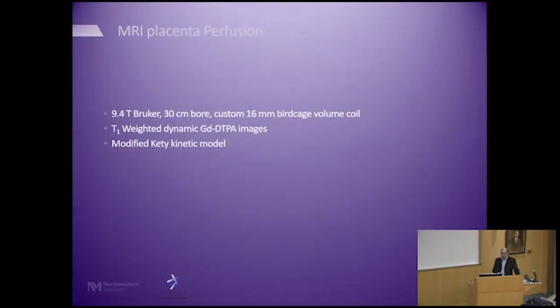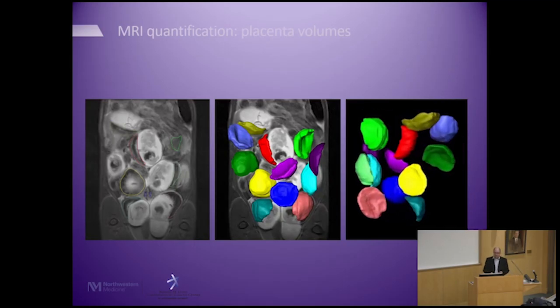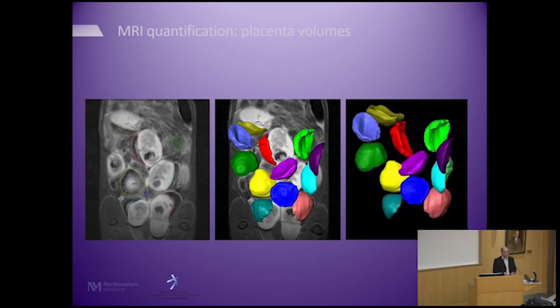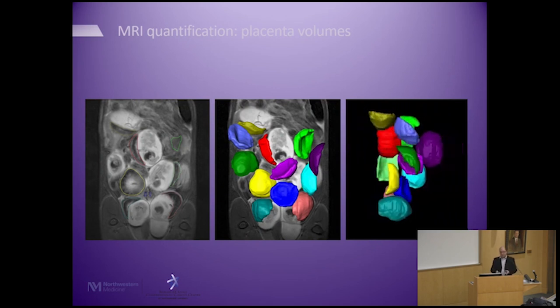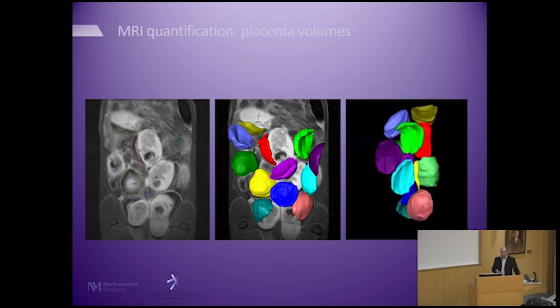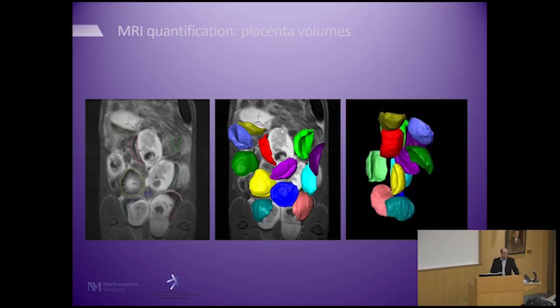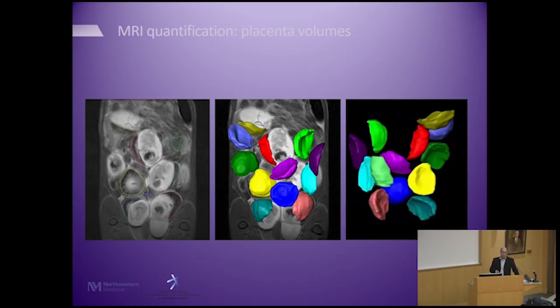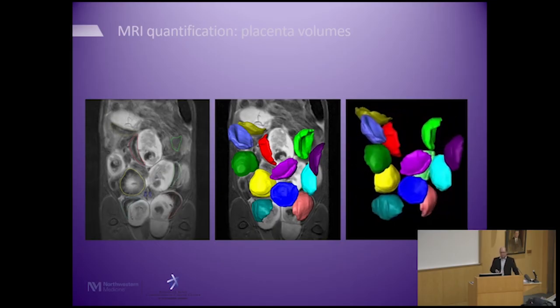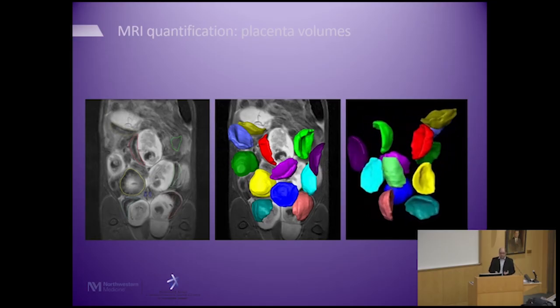So this is a project that I was working on. Again, it's not cancer related, but you can imagine this would work for tumors. In this case, we're imaging placentas. And again, the similarity between this and cancer is this is a model of preeclampsia where you have changes in vasculature to the placenta. So you can imagine with some therapies in cancer treatment, you'll get changes in vasculature and blood supply to the tumor. So there is definitely overlap.